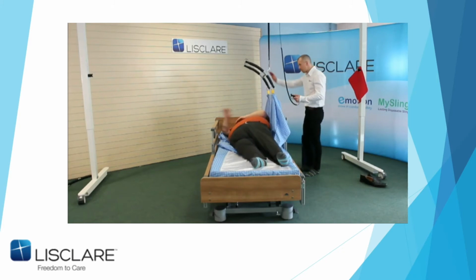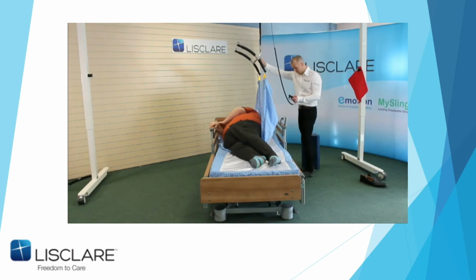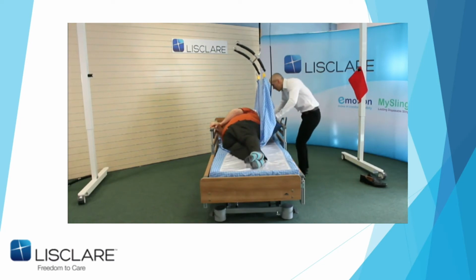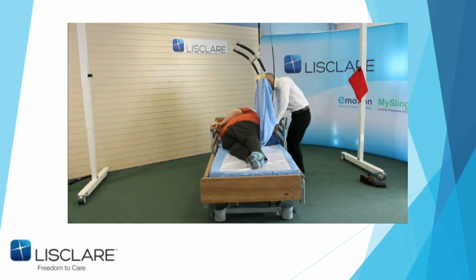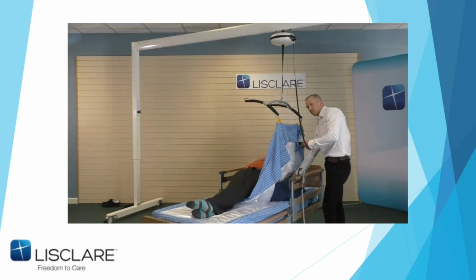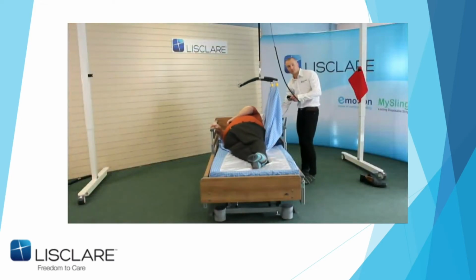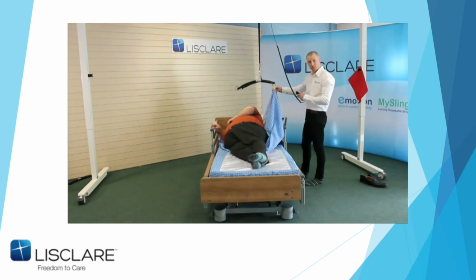And you can see naturally, I'm going to try and push and shove. That's you, John. I'm turned. At that point, John can put the wedge in and lower it down. And even with my mass, you can see, I don't know whether the camera angle's changed, Ruben. You can see it just won't move. So you could do personal care.